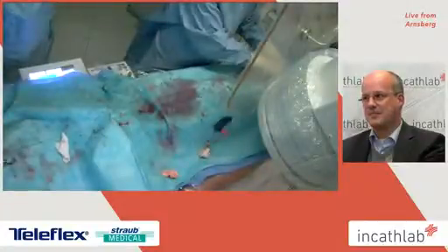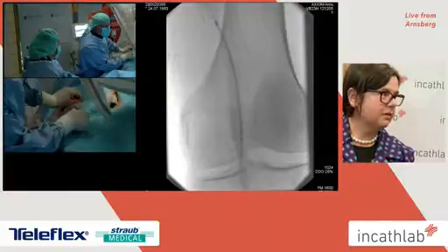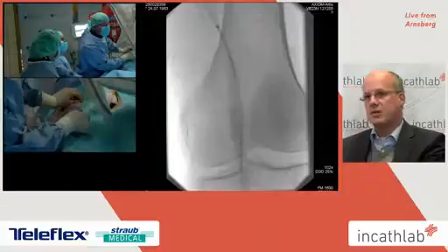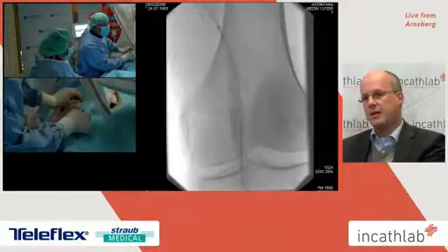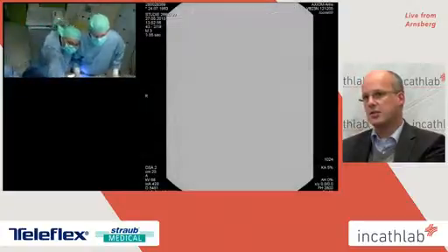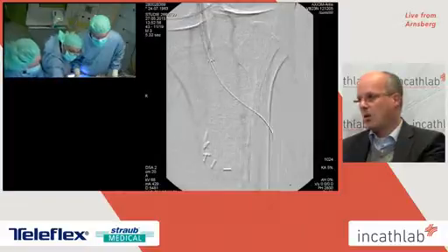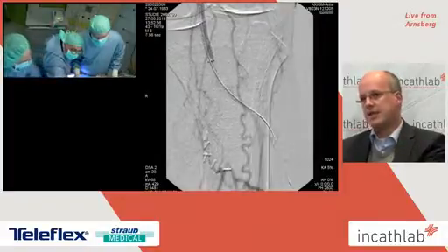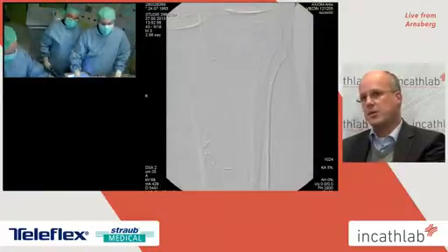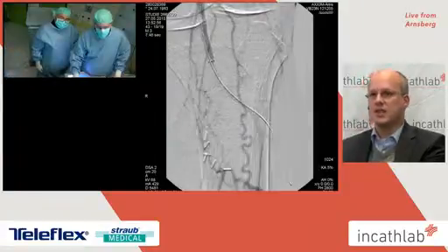And don't you think that there is also a problem at the distal anastomosis? When you see the aneurysm there. We did not have a lot of information about this patient, because he was treated far away. What we know is that this is a P1 artificial graft bypass, and they did the ring stripper therapy of the popliteal artery. There was also a subtotal occlusion of the popliteal artery, and that's why we decided to stent this part.